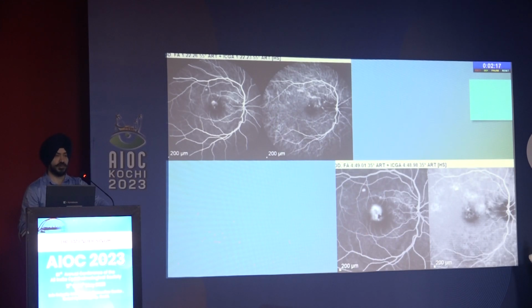So I would like to conclude by saying that fluorescein angiography is not a dying art. It should not be, at least I want to believe that, and I would encourage all the postgraduates to learn and understand by seeing more and more images.